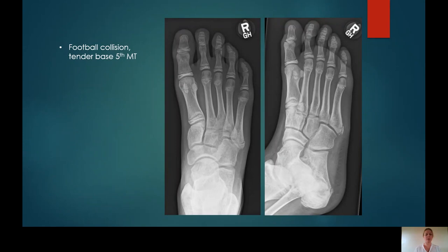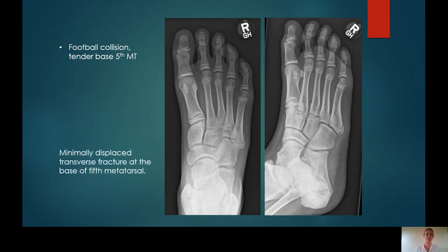Case 7: Football collision, tender base of fifth metatarsal. This x-ray is a little harder in that they have a base of fifth apophysis — this is a normal base of fifth apophysis with a longitudinal line. However, there is also a transverse line at the base of fifth metatarsal. So: normal base of fifth apophysis, but there is a transverse fracture also extending through that base of fifth metatarsal.